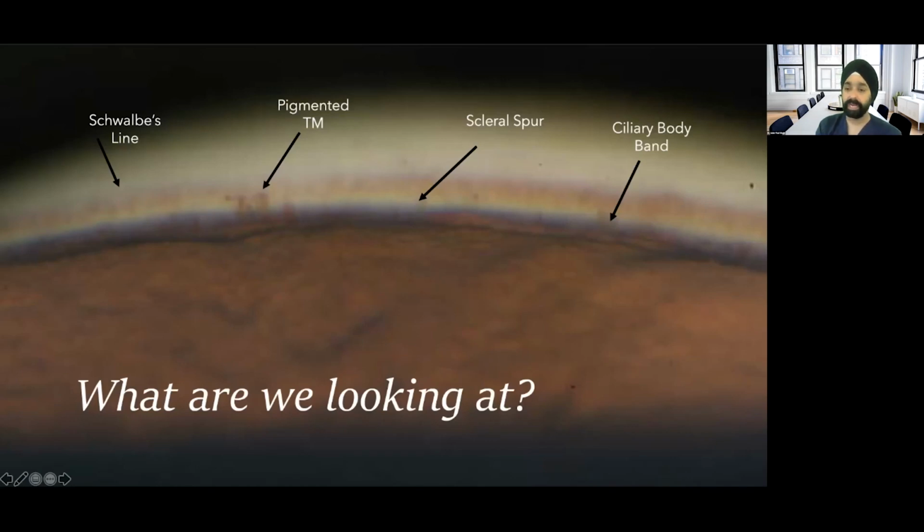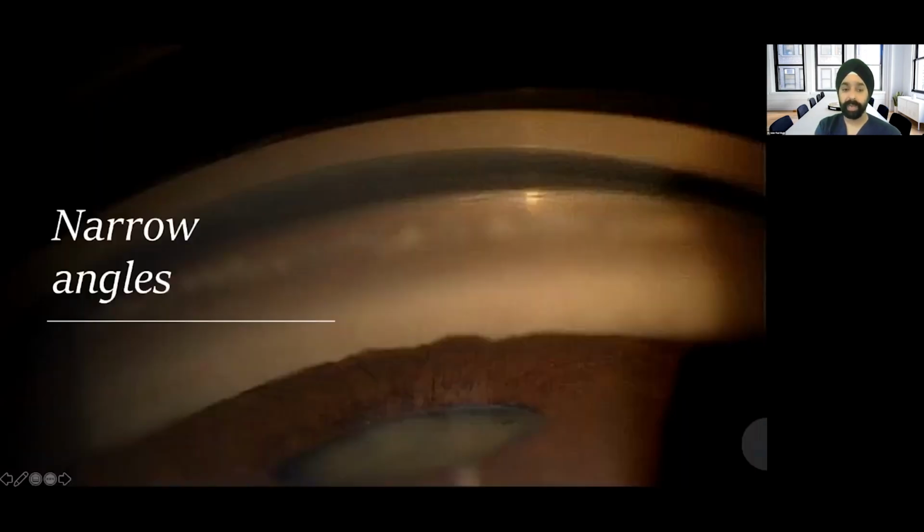Now, it's important sometimes if you have a narrow angle, you may see the ciliary body band, and you may get confused and say, hey, this is an open angle. Remember, if you don't know whether this is an open angle or a narrow angle, and you see one brown line, try to look for the 2 white lines. So if you see the scleral spur and you see Schwalbe's line, if you see 2 white lines, the TM is in between. Because sometimes the trabecular meshwork is not pigmented, it's not easy to see, and that will give you a better understanding: is it someone who has an open angle or more of a narrow angle?